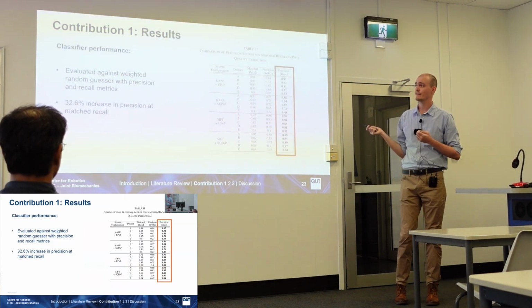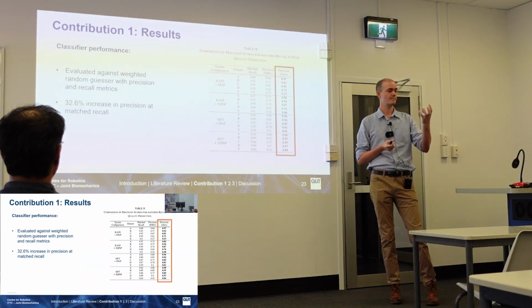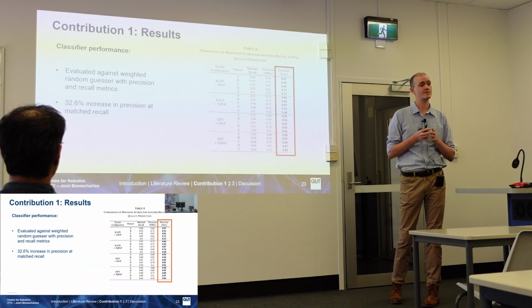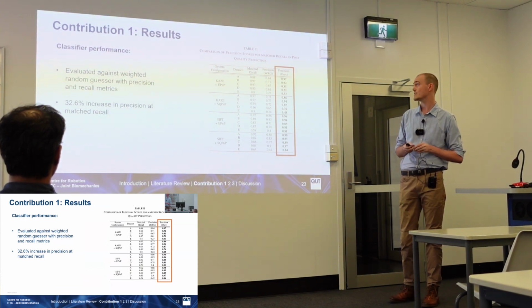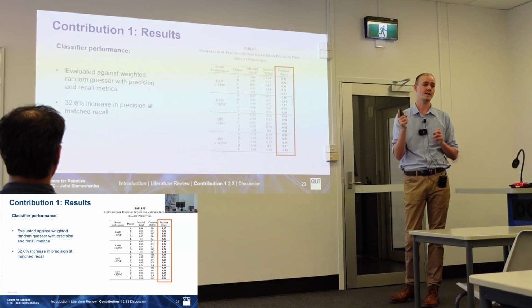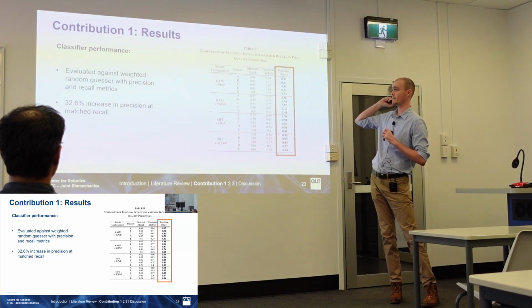Our first set of experiments evaluate our classifier model. So that's the binary classifier that predicts if individual pose estimates are accurate or inaccurate. To do this, we process each of our data sets through 4 different variations of our pose estimation system. We train our classifier on a subset of data from one of those data sets processed through one iteration of our pose estimation pipeline, and use it to predict labels for all the rest of our pose estimates in all of our data sets.